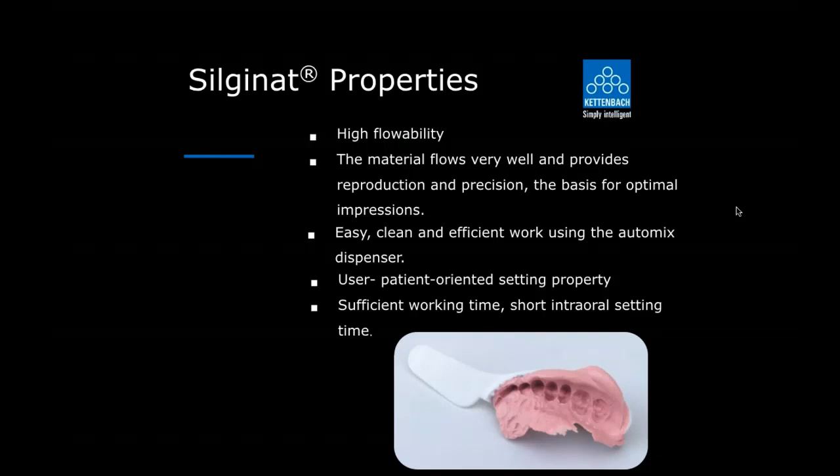And this makes a beautiful temporary. It is so easy to do. I always share with doctors how I go back to the days where we used aluminum temporaries out of the box, or in the anterior, we'd pick a temporary out of the box and fill it with jet. But nowadays with the acrylics that we have for our temporaries, this makes it so easy to do, and it doesn't take long at all. And you have very little trimming you have to do. A lot of times, if it stays on, you don't even have to cement it on. So it's a great material for using for that.